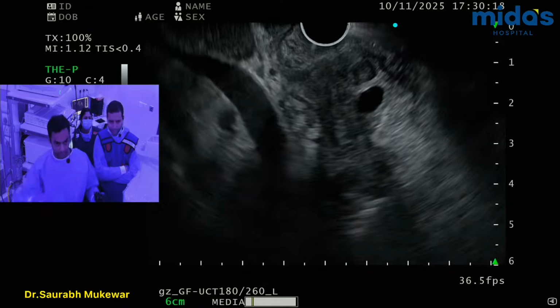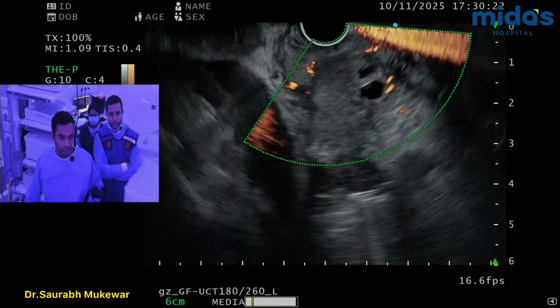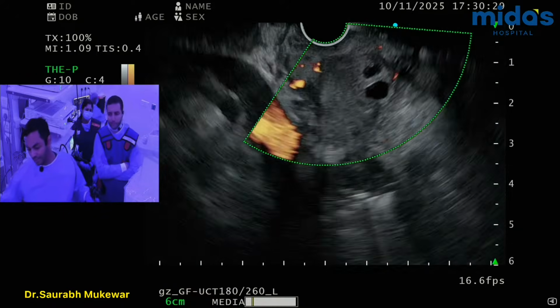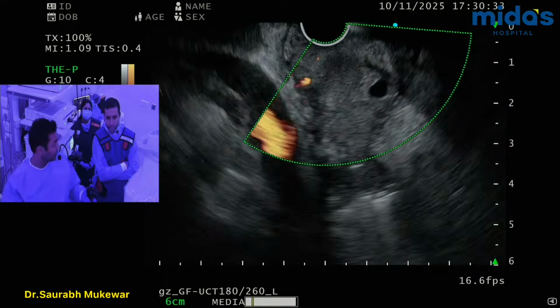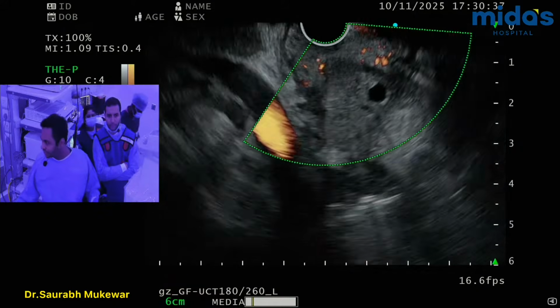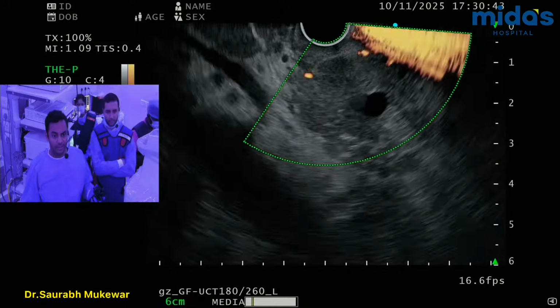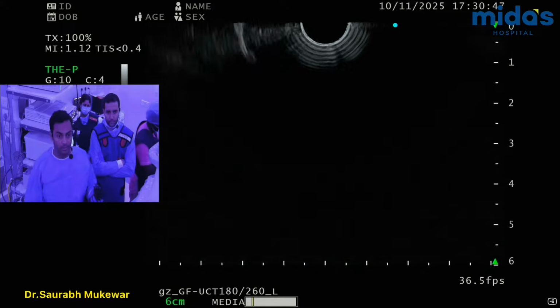Reduce the height. Fluoro, where's fluoro? Call the fluoro from the other room. Where is Snehal? हाँ बोलो ना CDS के लिए है तो. Alright. Okay, here we go.